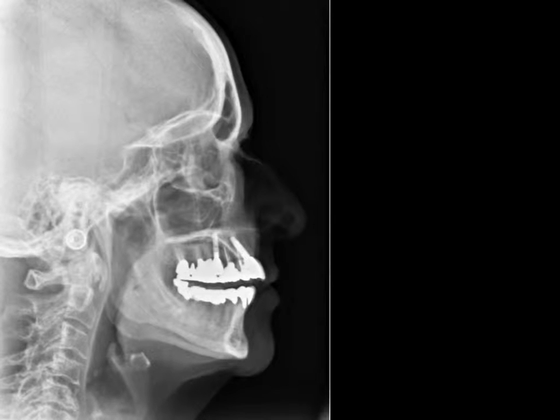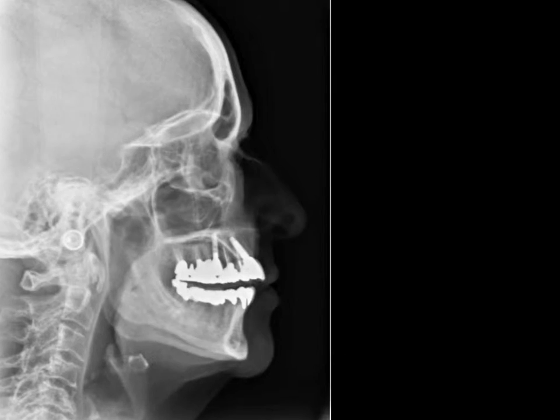Now, we're talking about a patient who's had a lot of dentistry here, obviously. You see all the crowns and implants and whatever. And if you look at the airway, it doesn't look too bad, but it is deficient when it was tested. And so if you put a radiograph beside it where we've placed a Herbst appliance and moved the jaw forward about 7 millimeters, you'll notice that the airway is much larger, the patient's happier, and they're breathing well, and they got a result very similar to CPAP.